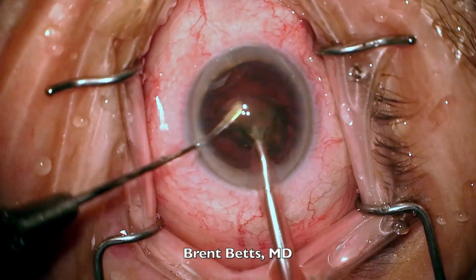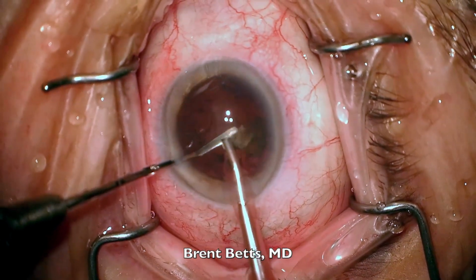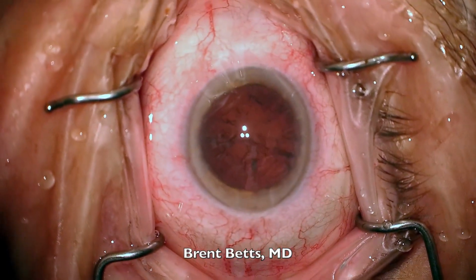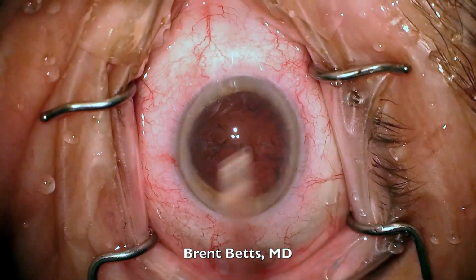Part of the reason that the cataract is broken into smaller pieces is we end up using less ultrasonic energy, meaning that the cornea is less swollen on the day after surgery and people end up seeing better quicker. Also, long-term outcomes are better when there's less corneal swelling.